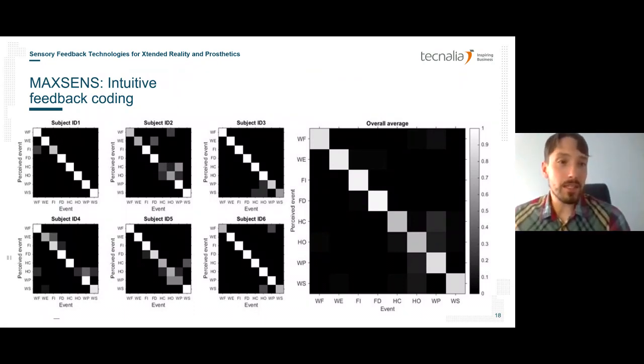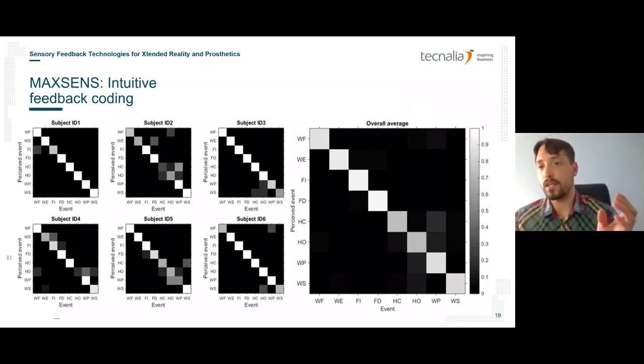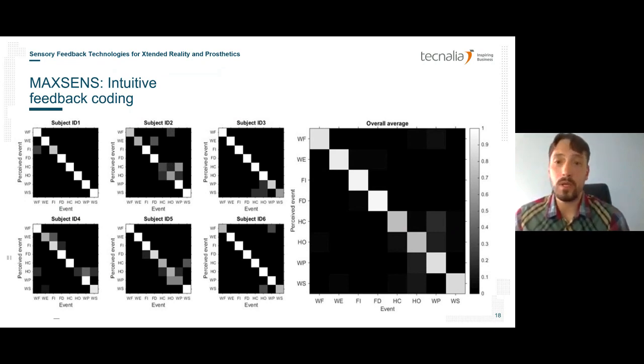And what we did then is we wanted to really confirm that this type of dynamic stimulation patterns can be recognized by the amputees. And we did this study on 6 amputees. And similarly, as when we tested stimuli location and frequency identification, there was only a short couple of minutes of reinforcement learning before testing whether or not they can really understand the feedback message. So the feedback messages were whether the hand is being opened or closed, whether it's being rotated in pronation or supination, whether the force is being increased or decreased, and whether there is the flexion or extension of the hand. Because this is what we found to be, for instance, in the latest version of the Michelangelo prosthesis that we used as the reference.